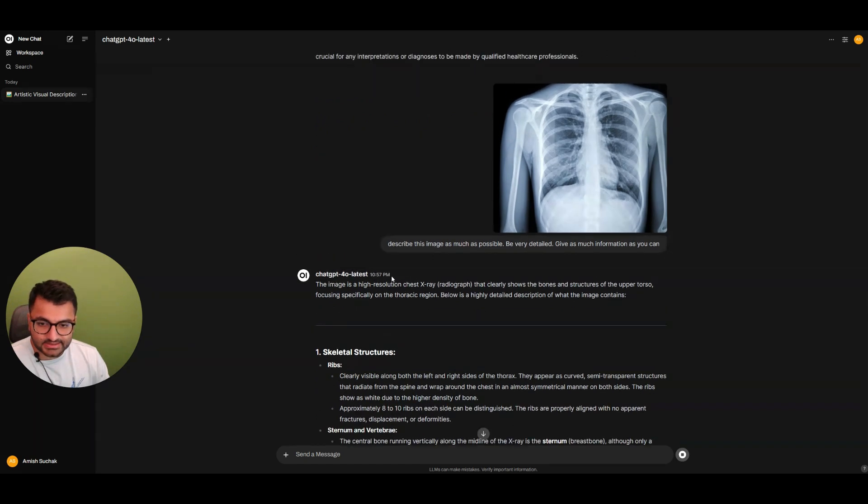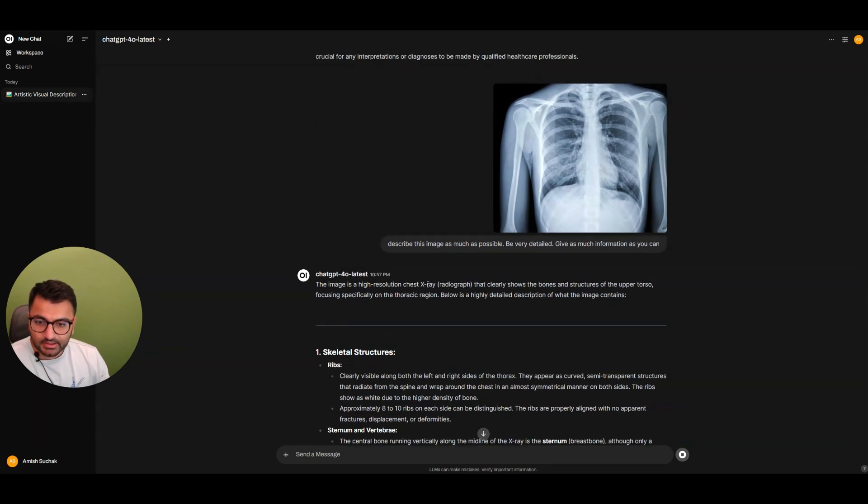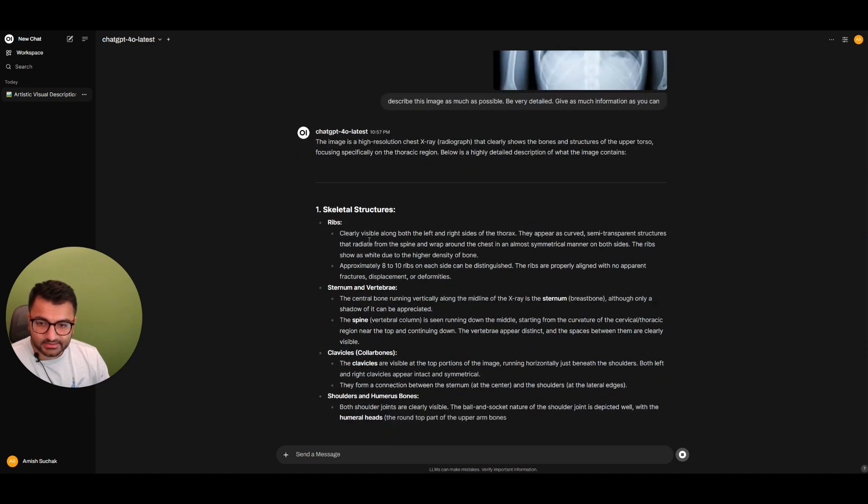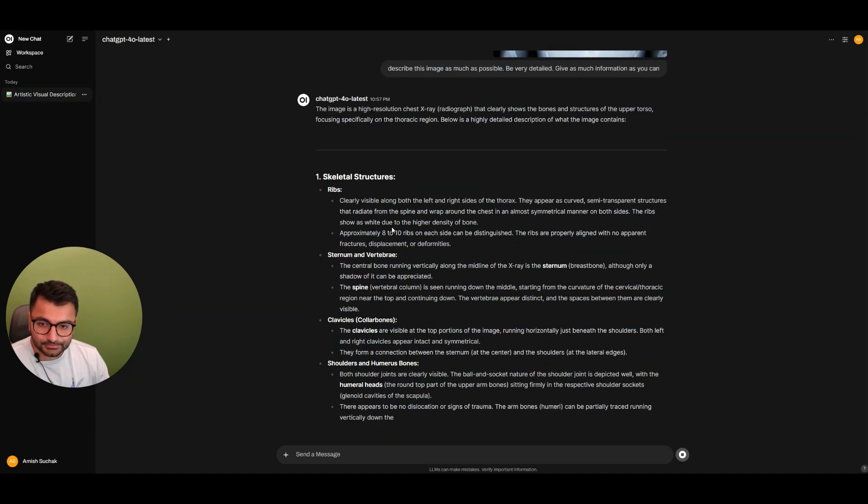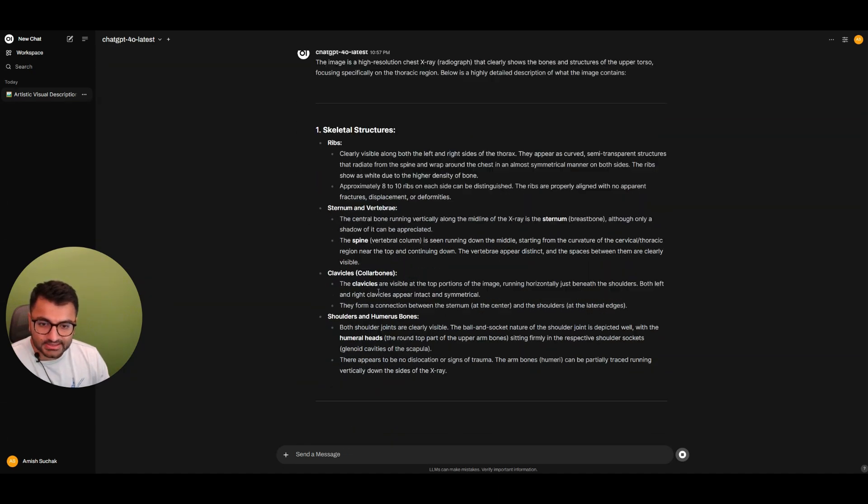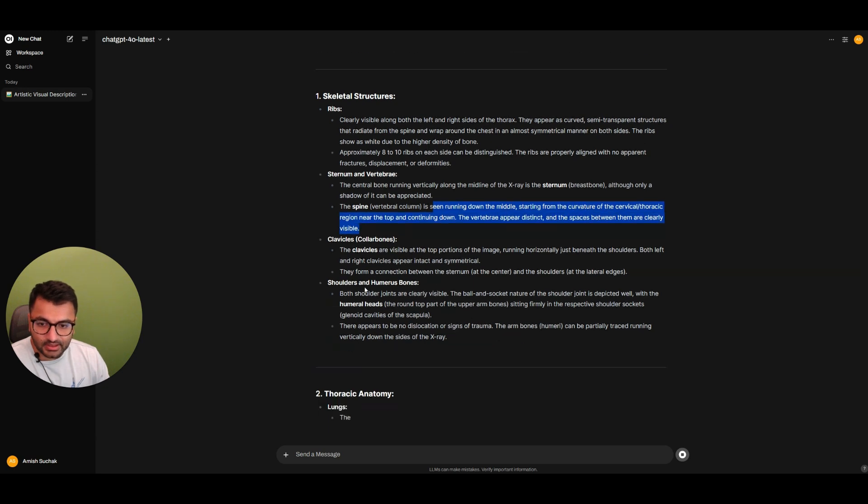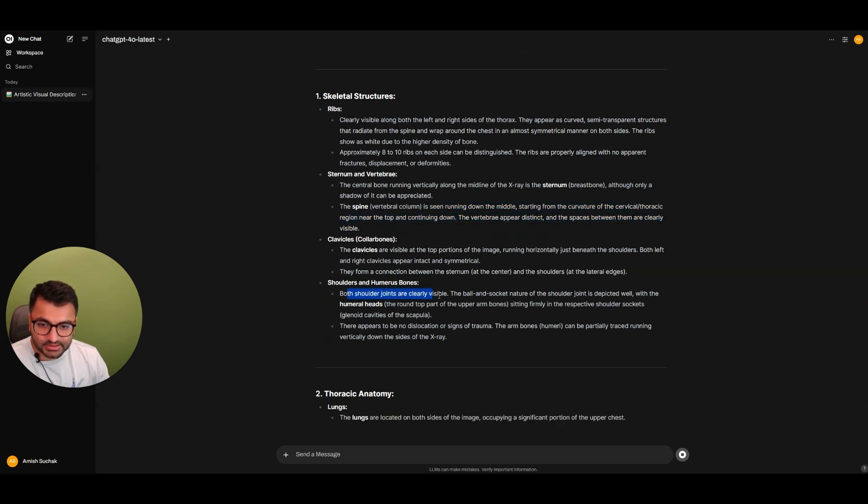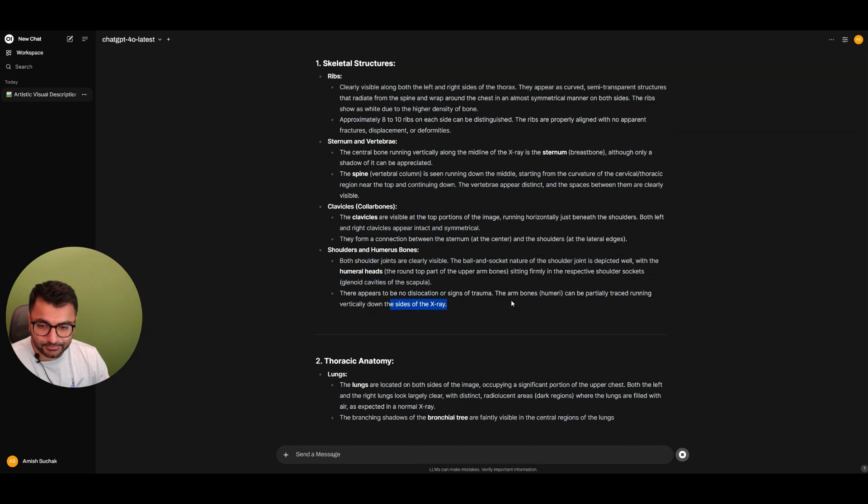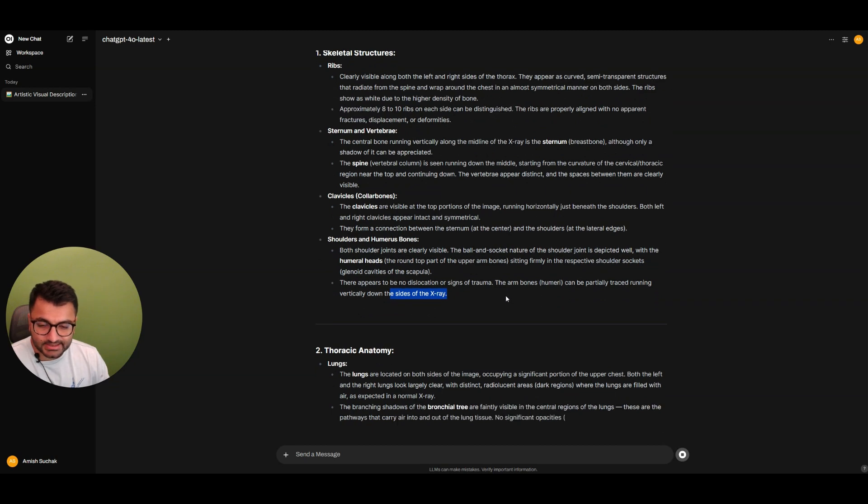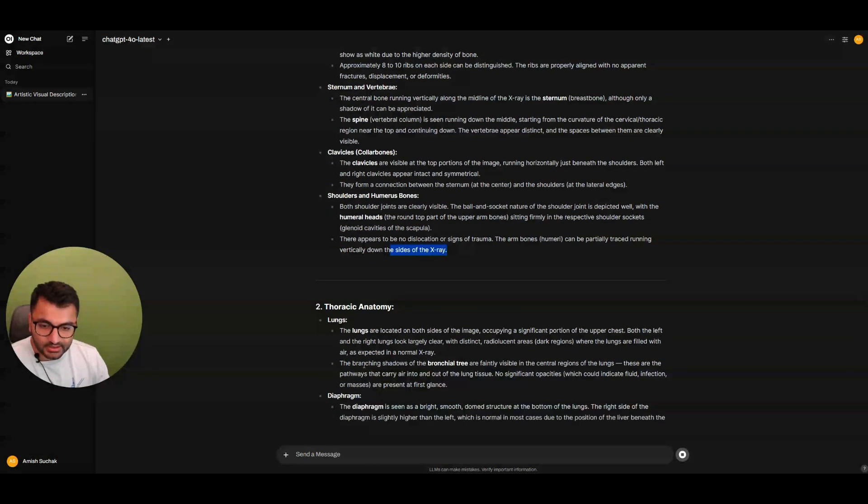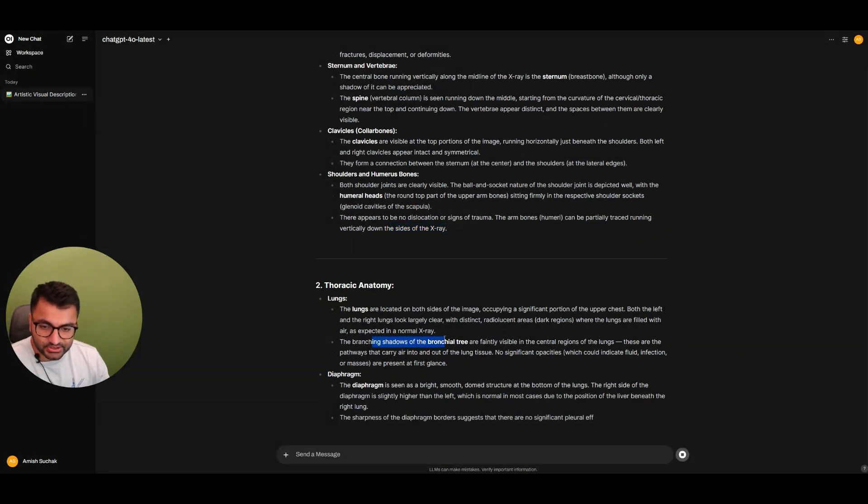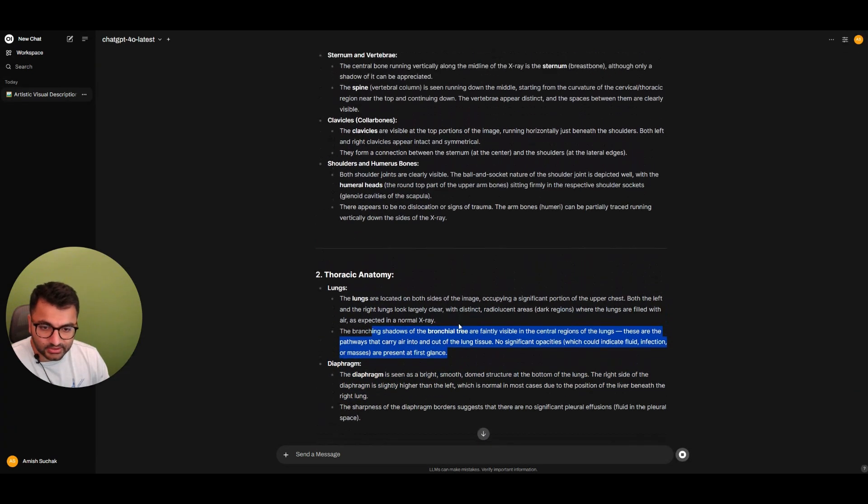Okay, so it says it's a high res chest x-ray and skeleton structure. Ribs are clearly visible. Spine is seen right on the middle. Shoulders are visible. There seems to be no dislocation. It's talking about the lungs. The branching shadows of the bronchial tree are faintly visible on the center regions. These are pathways that carry air.